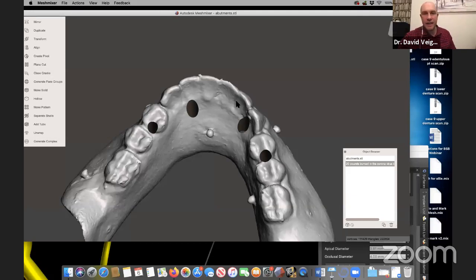Can you explain the stages of temporary prosthesis used before the final prosthesis in full arch cases? Yeah, okay. Great question. So as my evolution of how I convert these full arch cases into the final restoration, I've tried to minimize the amount of surgery time, but get the maximum amount of data to my technicians.